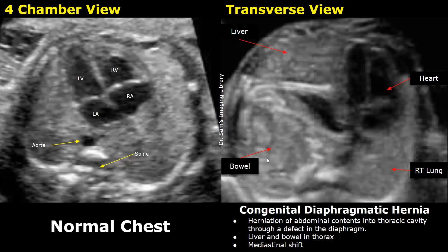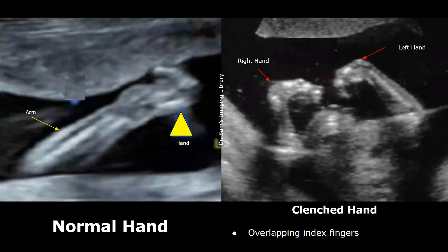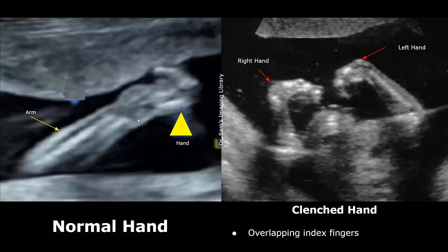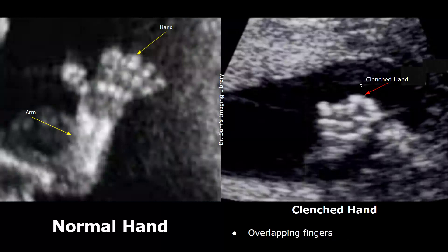A clenched hand is more commonly seen in Edwards syndrome. The hands will appear folded with overlapping fingers and will constantly maintain this position. The normal hand will appear with distinctly visible fingers, thumb, and arm in their normal positions. But in Edwards syndrome they have an abnormal shape and position, with overlapping fingers and a folded hand.